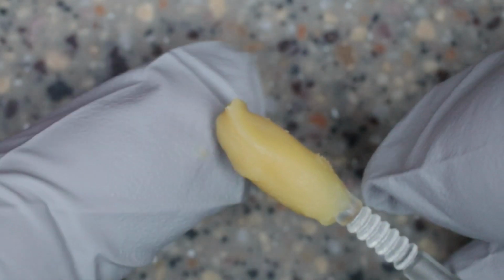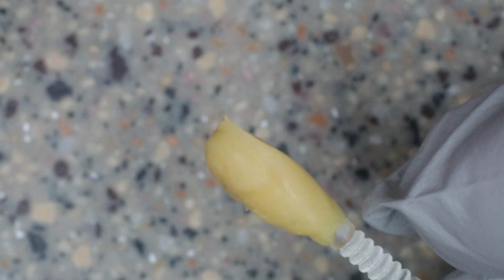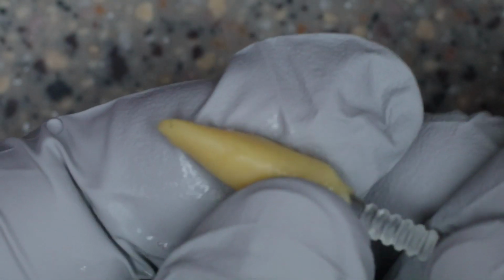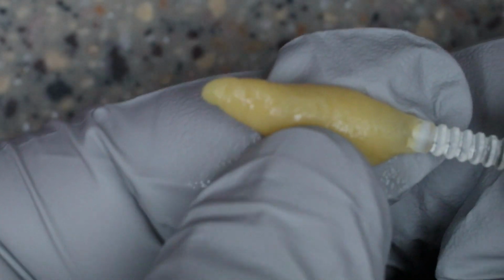Because this is so sticky, you're going to need some kind of wetting agent or something to keep it from sticking inside the crown. So I like to use just some water. And that really seems to help out a lot by getting this wet. Okay, and we're just going to shape it how I really want here, but remember, we got to stick this in the crown. So I like to make it a little more pointy on the end, so it kind of fits into the crown a little bit better.